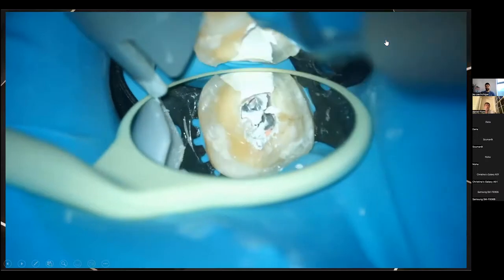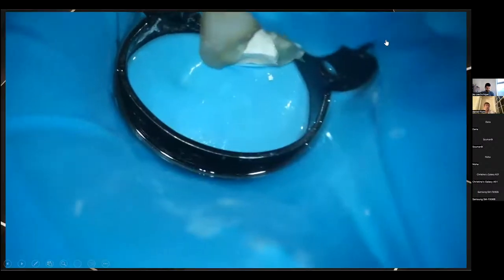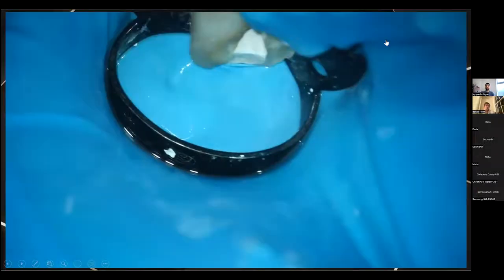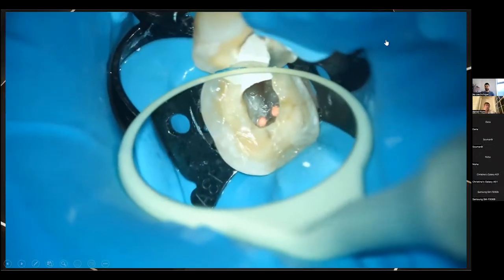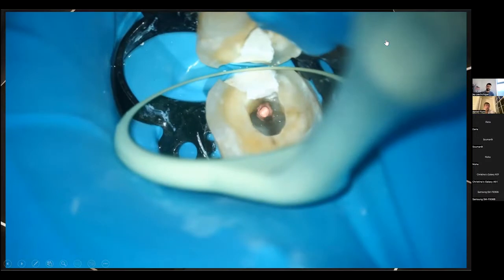It's just about 10 seconds with a scaler. And I do just fast forward it here a little bit, just so you know I wasn't cheating. Just 5-10 seconds with an ultrasonic scaler, and it's very, very easy to clean, with no alcohol in your brush. And compared to the resin-based sealers, it might save like 20 seconds, but it's so easy.